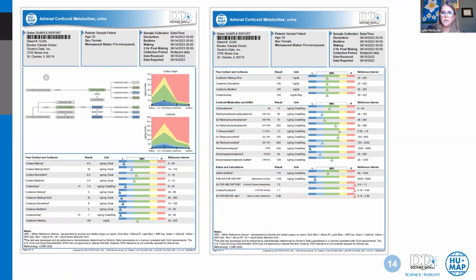There's about a 2-hour delay for cortisol levels to show up in urine. And also keep in mind that levels in urine also reflect an average of all of the urine that is pooled in the bladder since the previous void. The waking sample is a reflection of overnight secretion. If the patient collected a nighttime urine sample, it's added to the AM sample, and that data is reflected in the waking value.